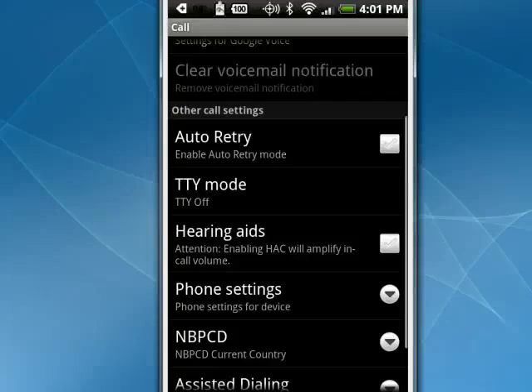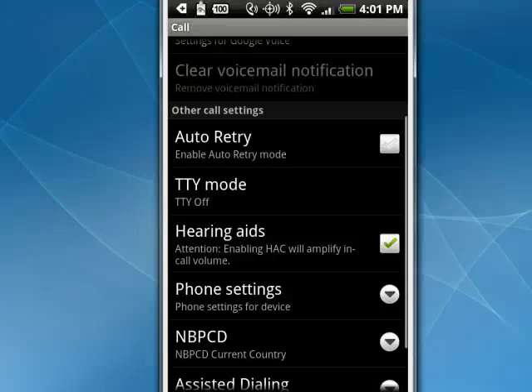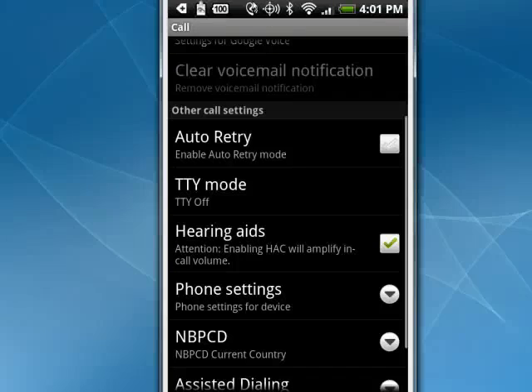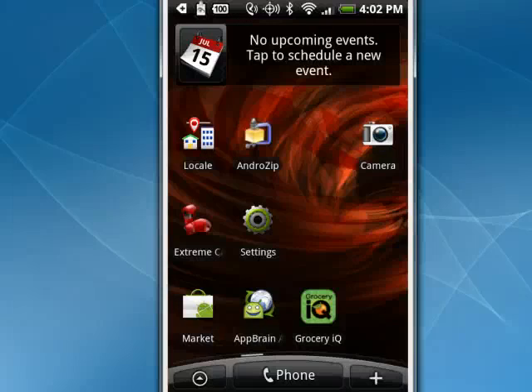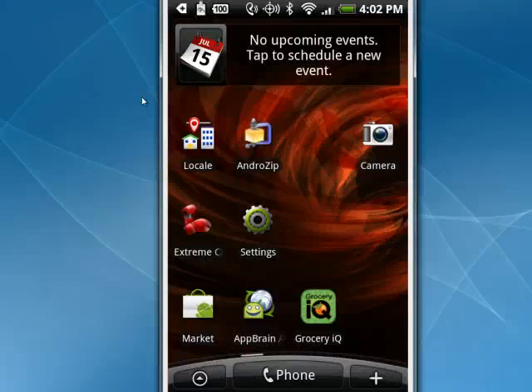So, you can tap that so it has a checkmark next to it, then go back, and you're all set. You can use your Android phone with a hearing aid, and that's all there is to it.